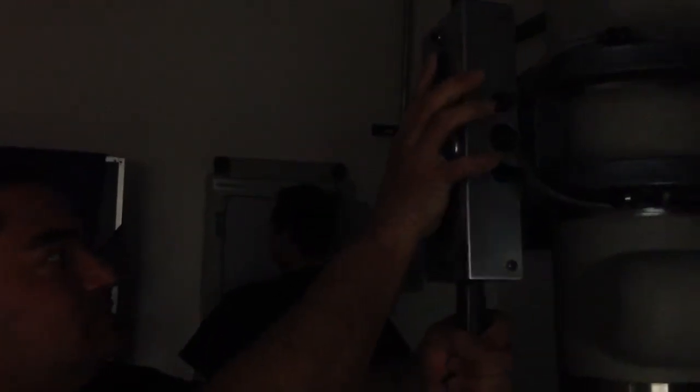Now if I do the caudals, what's changed? Triangulation. 15 down, right? Now, it's kind of hard to do it on this, so we couldn't do this on Carlos or Chad. Go ahead and put your right shoulder against the board. Right, look towards me. This is for PA. PA oblique, right there. 15 to 20 down. Do the other side.